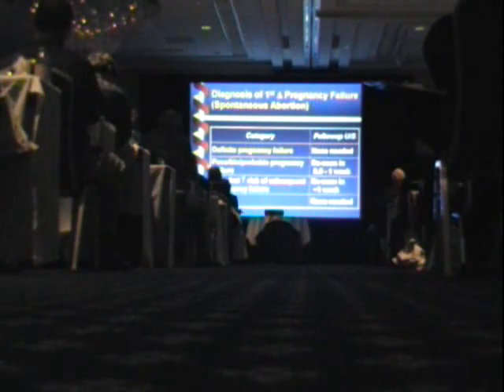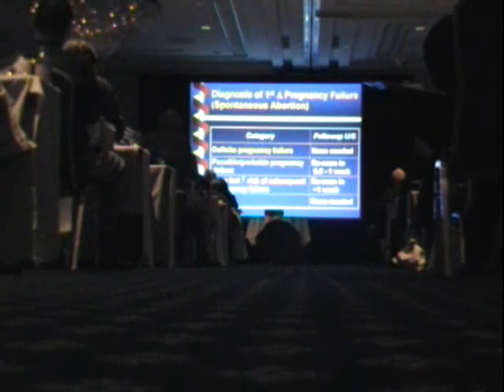Another category to put it into is possible or probable pregnancy failure, in which case you want to rescan in a few days to a week. Another category is that the baby is alive now, but you see a finding that puts the pregnancy at elevated risk of subsequent pregnancy failure, in which case you'll also rescan several days later or recommend it.